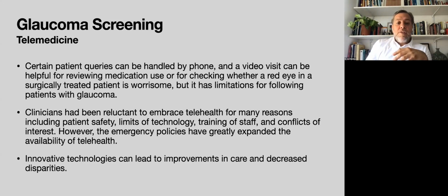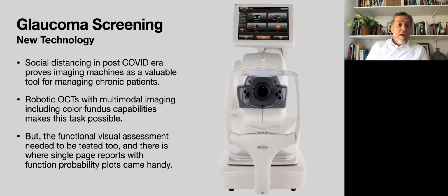Sometimes clinicians have been reluctant to embrace telehealth for many reasons: patient safety, limits of the technology, training of the staff, conflicts of interest. There are a lot of different reasons. Innovative technologies can lead to improvements in care and decrease these disparities. So in the social distancing post-COVID era, imaging machines prove really valuable for managing chronic patients.